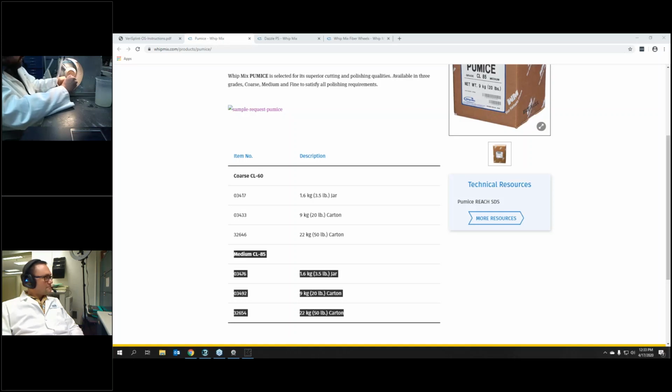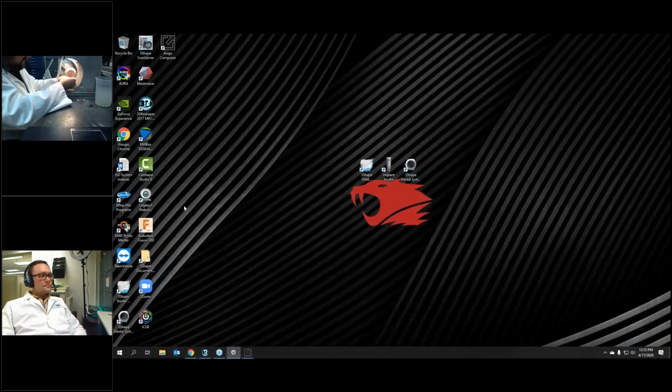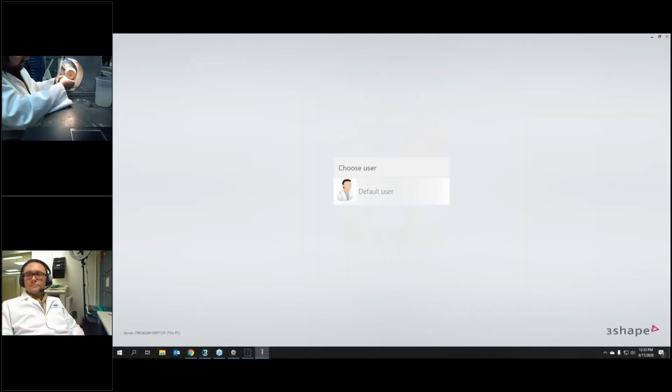And if there are no questions, Evan, if you want to go ahead and pull up maybe the Splint Studio, you can walk through a design and cover it again while we're going through. I mean, people can watch both screens. This part that we're doing right now is pretty self-explanatory. We're just pumicing the actual splint itself.